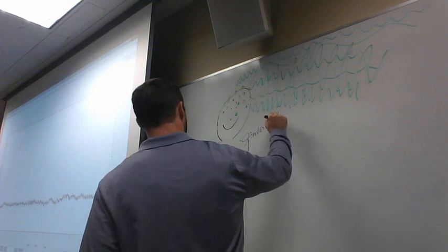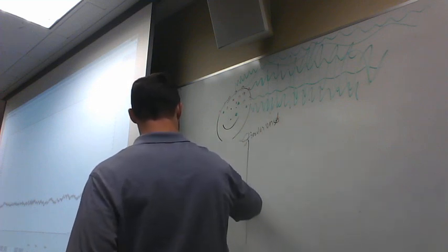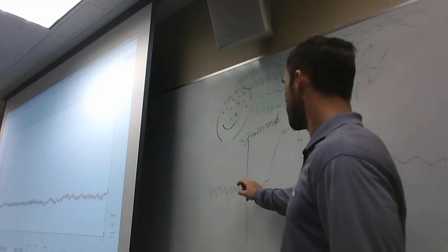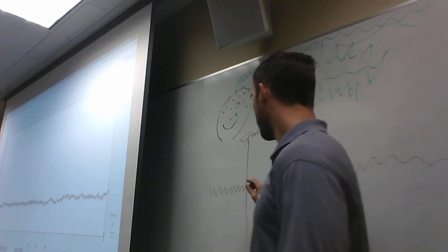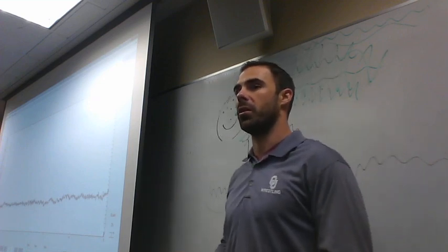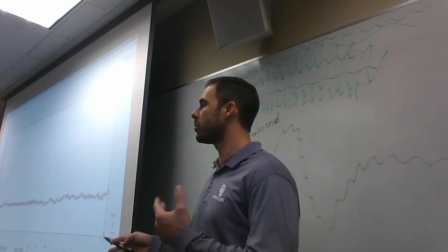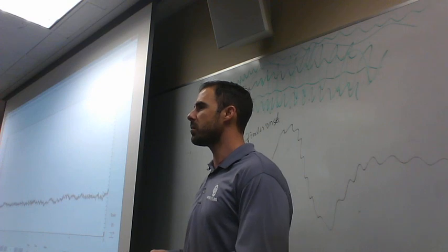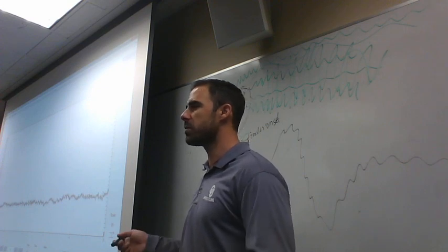Now you're always going to have some activity that you're also going to measure beforehand, and you're going to look at how that brain activity operates in relation to the stimulus. We'll talk about this baseline area too, because that's kind of our control area. We'll look at this activity relative to this as a control. Okay, so is that a sufficient basic overview for now?